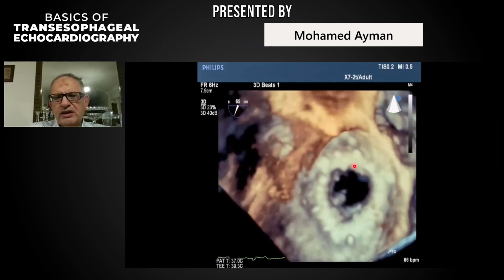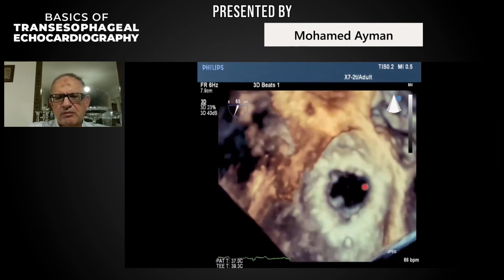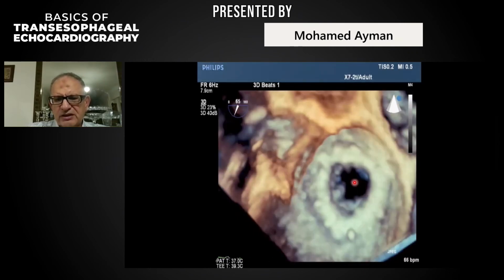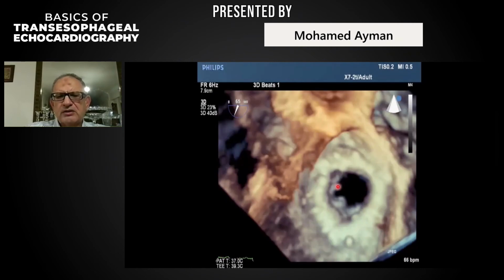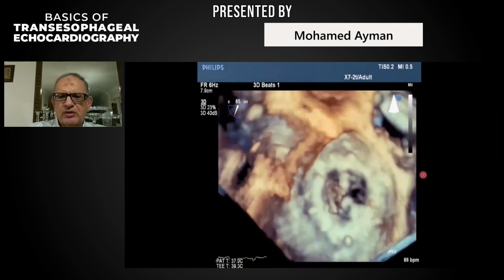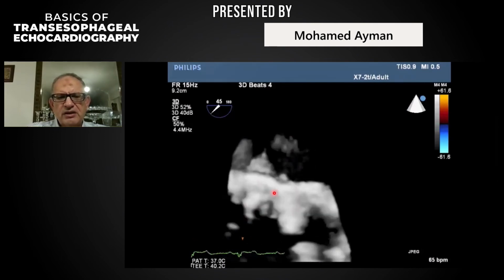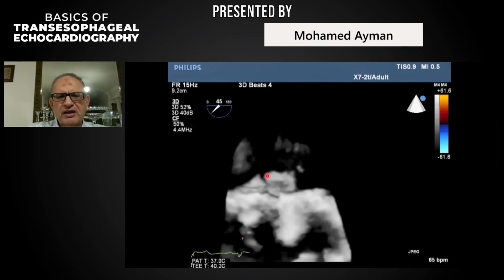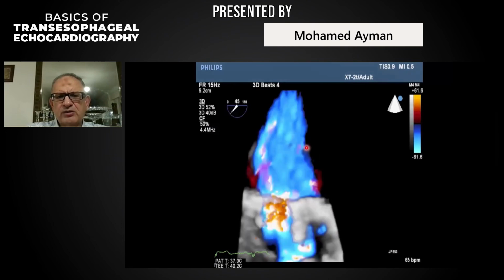And with a 3D TEE, this is the ring of the prosthesis in en face view. And here in the middle of this ring, you can see that those prosthesis leaflets are degenerated and torn, and there are multiple big gaps in between responsible for the severe prosthesis regurgitation. 3D TEE for the same patient, the ring, the stents, and these torn, shaggy leaflets. And this is the severe central regurgitation from the left ventricle back to the left atrium.